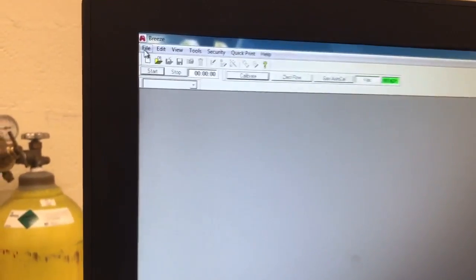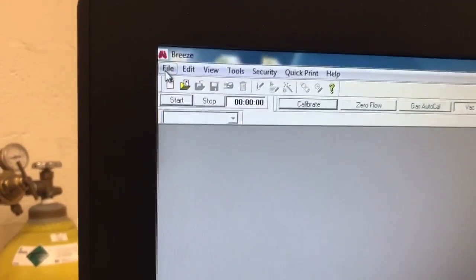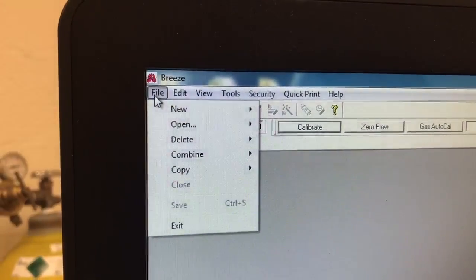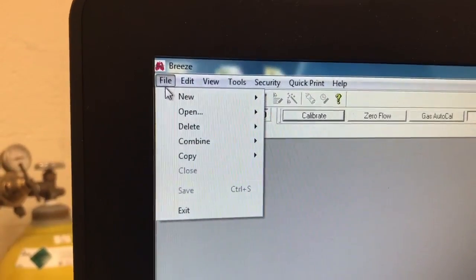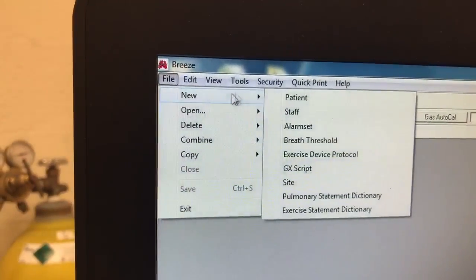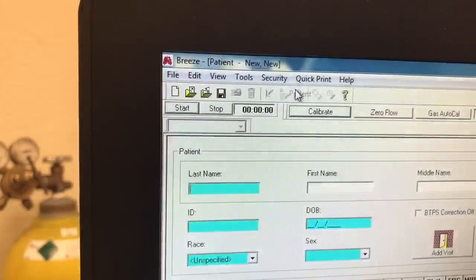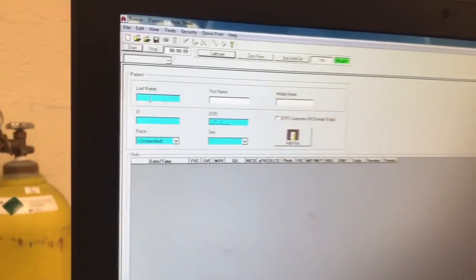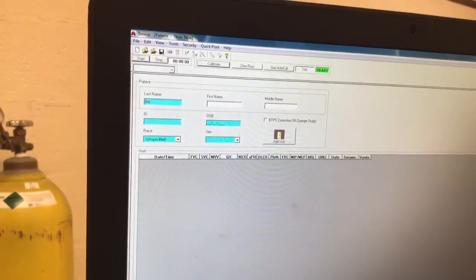Now one person can start entering patient information into the computer. Click file, new patient, and fill in the highlighted boxes.